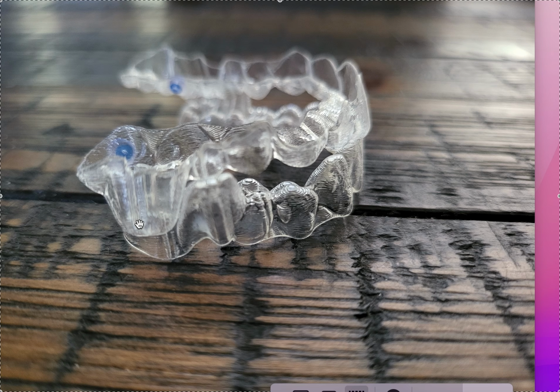So I can't tell you how to identify the right patient, but from my experience, the younger the patient is, and that's why I really like the Invisalign with MA, because you can start this as young as 5 or 6 if you want to. They're incredibly compliant. If you do this on a 15-year-old, they may not be compliant, but a 15-year-old is probably not growing either. Maybe a male might be. So that's why this is meant to be done at 5, 6, 7, 8, 9, 10, 11, maybe even 12. By 13, we're probably getting on too old for girls. And by 15, we're probably getting too old for boys. But again, you have to ask the questions.